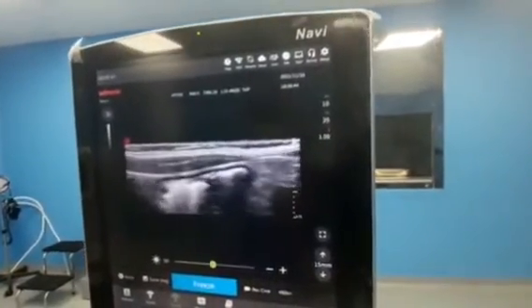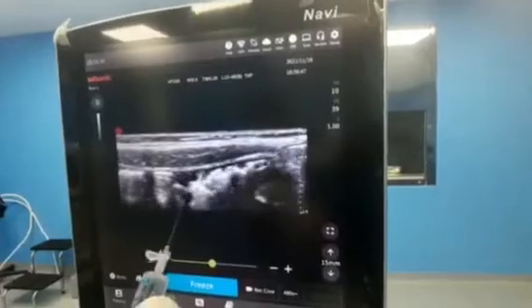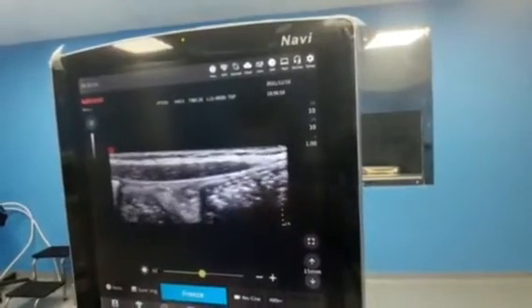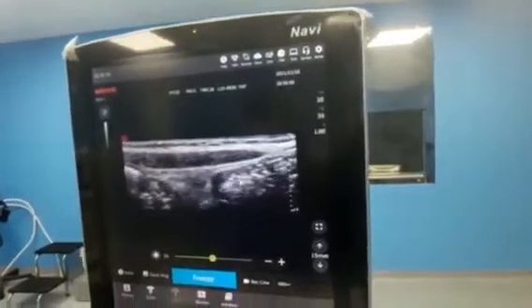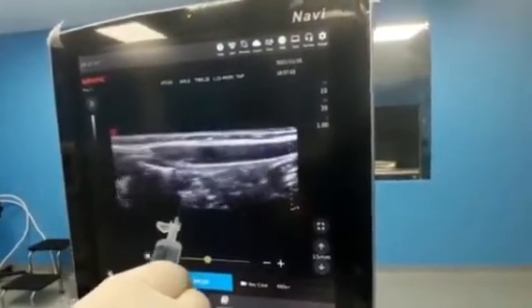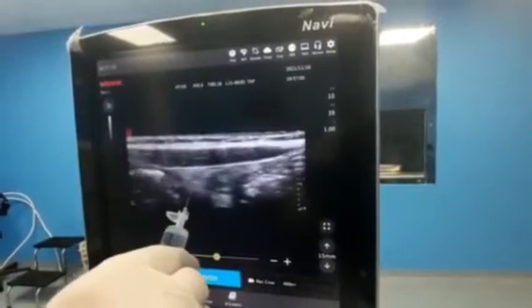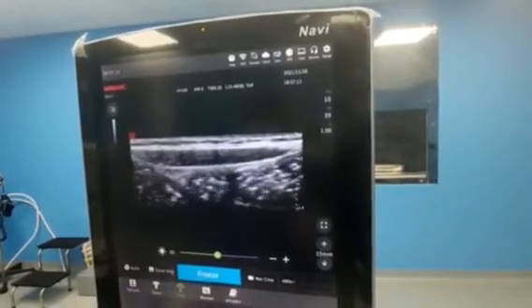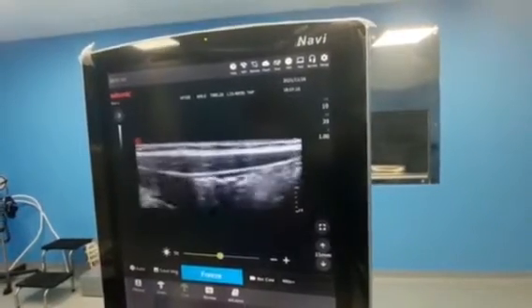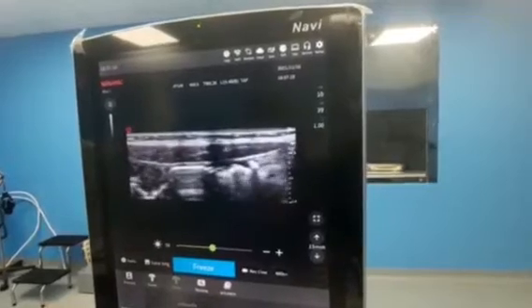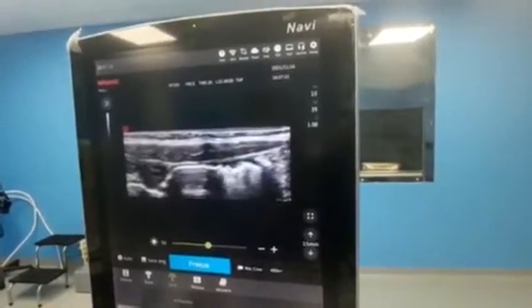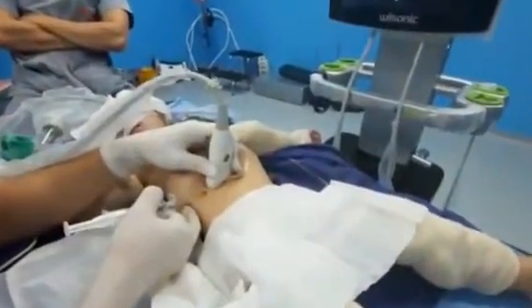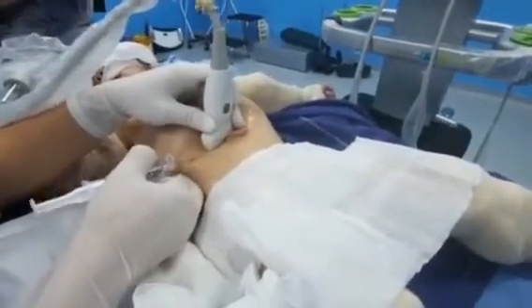It's very interesting to perform this block for abdominal surgery. We need to introduce the needle in the posterior aspect of the muscle because the nerve lies in this area. If we make the injection in the anterior aspect of the muscle, you cannot obtain good analgesia.